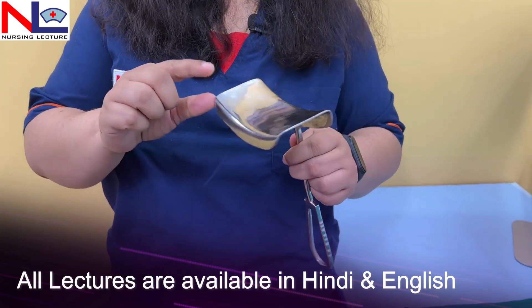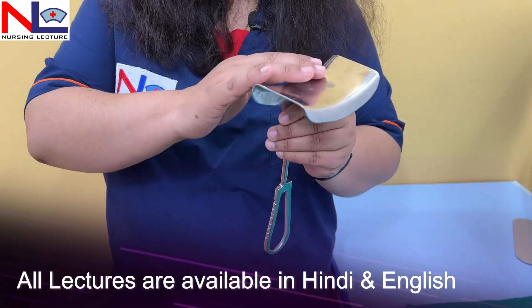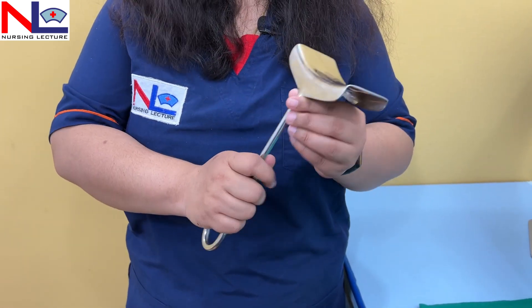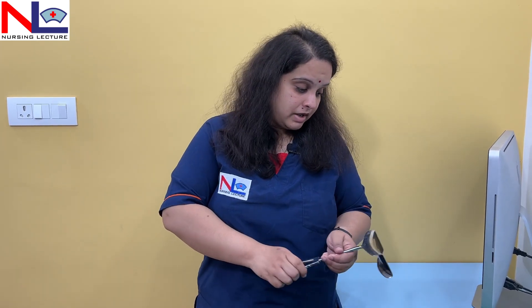Here I am showing the Maury's retractor. You can see the handle, and in Maury's retractor there is a broad blade which is angled at 90 degrees with the handle. This is mainly used to retract the abdominal wall. Some other retractors retract the bladder and surrounding tissues, but this one is mainly used to retract the abdominal wall away from the field area.